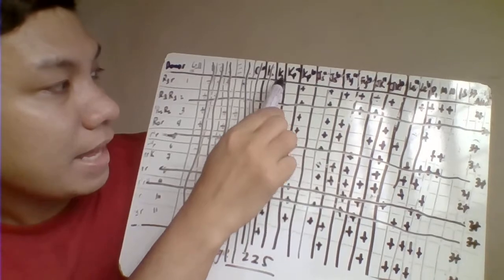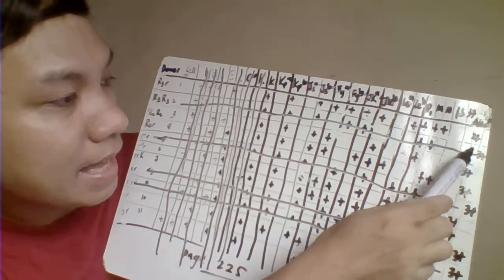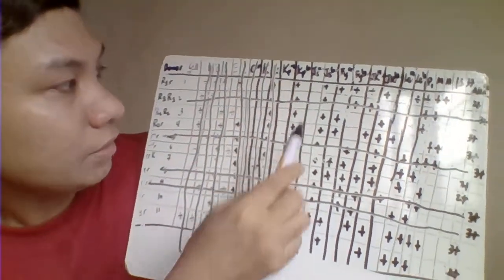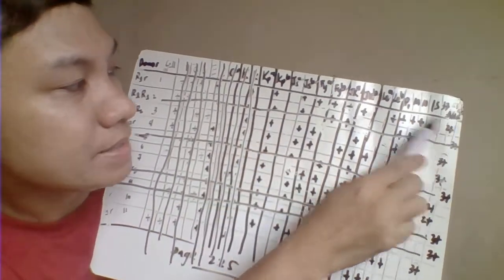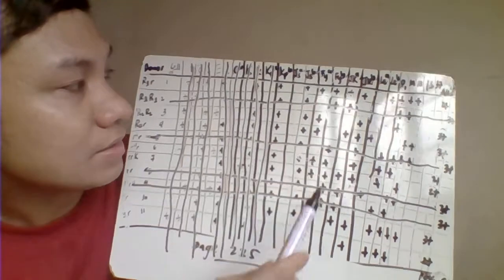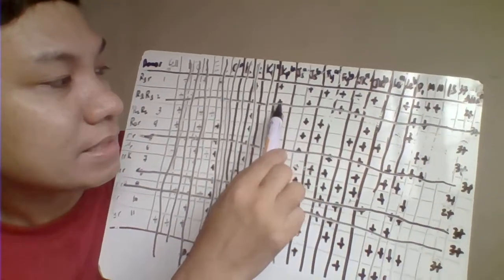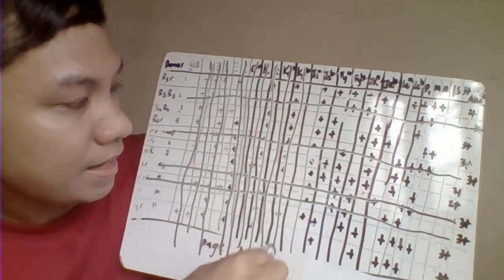Okay, next we have your K. Positive dito, pero dito ay positive result niya. Dapat negative. So, hindi itong hinahanap natin. Okay, ito naman sa KPA. Positive, sa kanya negative. Okay, hindi ikaw. KPB, positive. Positive siya dito. It's supposed to be negative. Okay, hindi ito hinahanap natin.